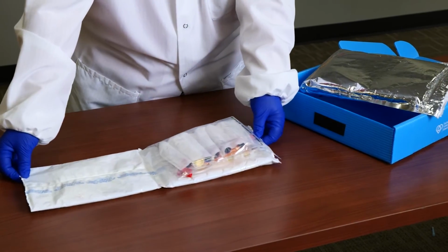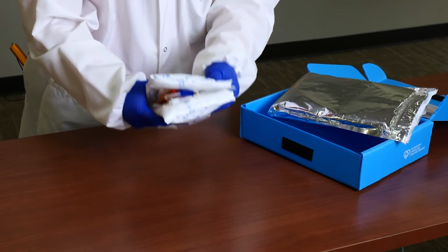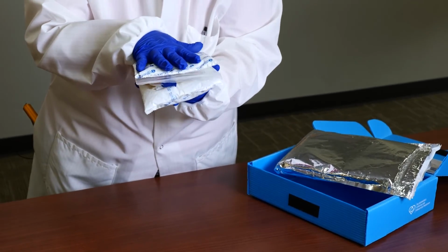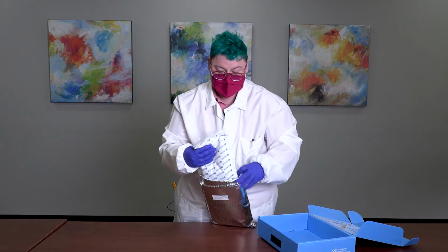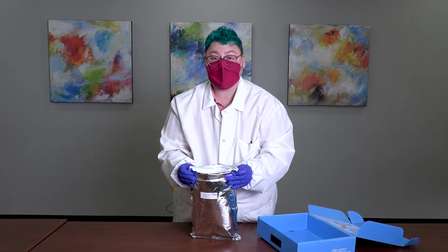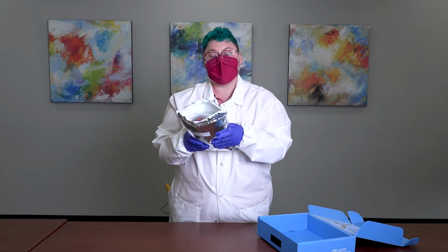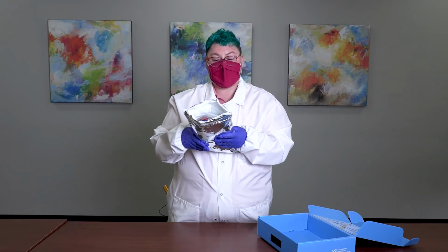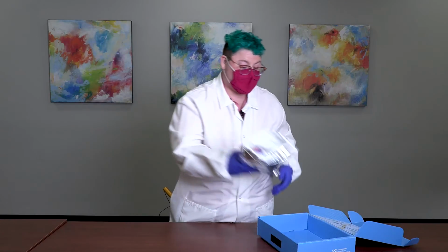As with our vaginal collections, you'll go ahead and fold over the gel pack until the ends are even, like a sandwich. This will be placed inside of the foil pouch and gently shimmied to ensure that the cord blood collection bag and the maternal samples remain nicely tucked inside the gel pack. After ensuring that the flaps are even, you'll go ahead and place the collection into the blue collection kit.